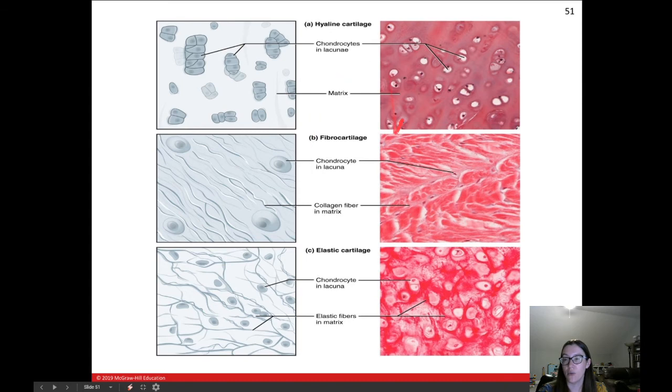Here we can't see any fibers that stain. This one is collagen that's pink. It's probably an H&E stain here. And this one is elastic fibers, and they are pink in this one and not black, so I think it's the H&E and not the Verhoeff stain. But a lot of them will show up black because black is really easy to see for elastic fibers.